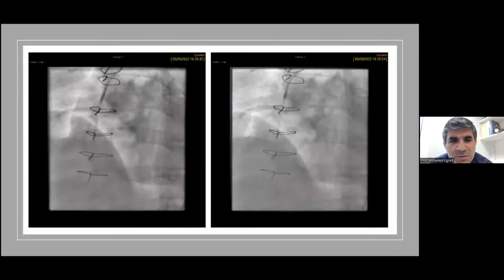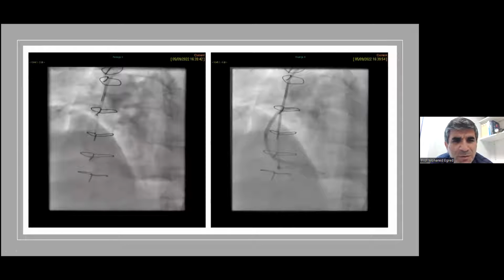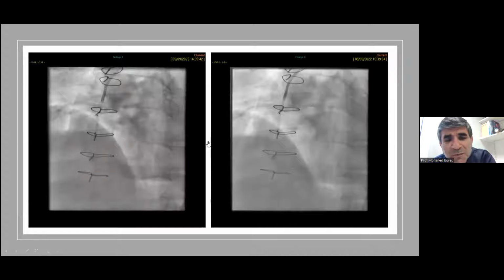In this case, I inserted a vascular plug, as you can see it there on the left side panel, because often if the vein graft is left, the competitive flow could lead to thrombosis or restenosis. But anyway, this was a case where, having tried, of course, I could have used laser, but with the heavy calcification, I think the Alveo balloon made life much easier and allowed me to deliver the microcatheter to exchange for a rotawire and perform rotablation.